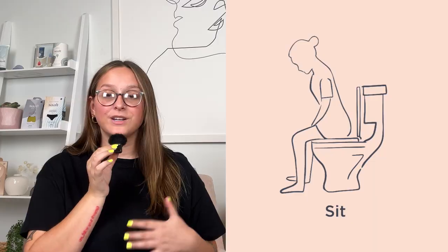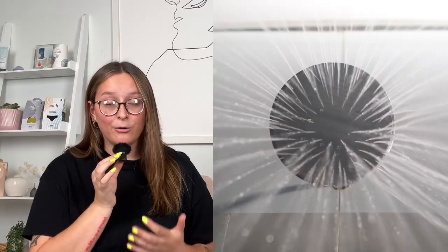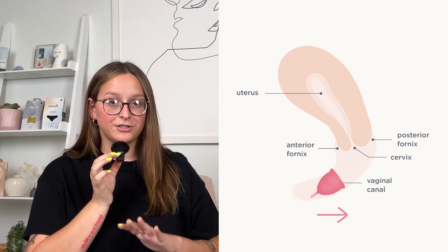Now you're ready to insert. Relax your pelvic muscles. You can sit on the toilet or stand with one leg elevated. And inserting in the shower is another great option. Hold the folded cup and gently insert, angling it back behind the tailbone and not straight up. You can also use water or a water-based lubricant for easier insertion.